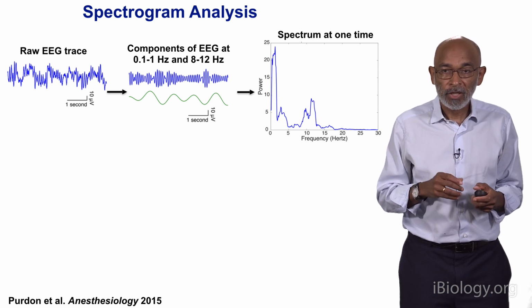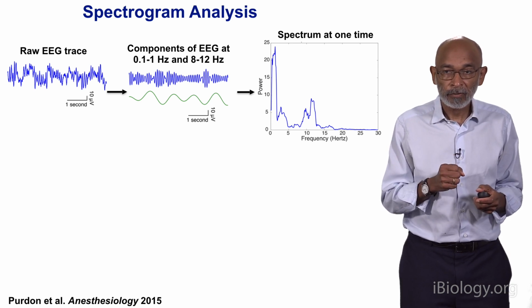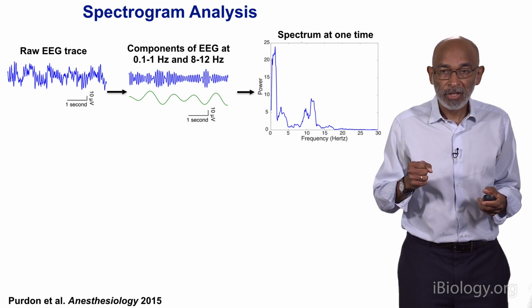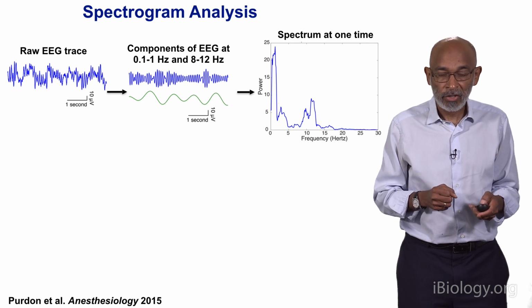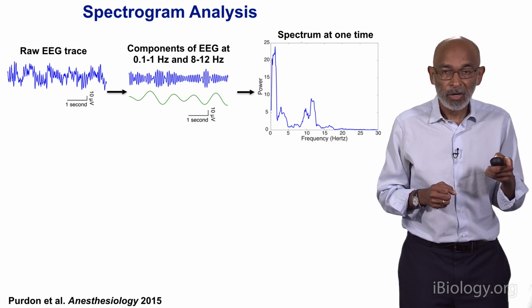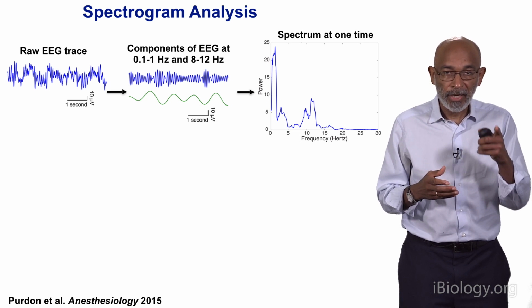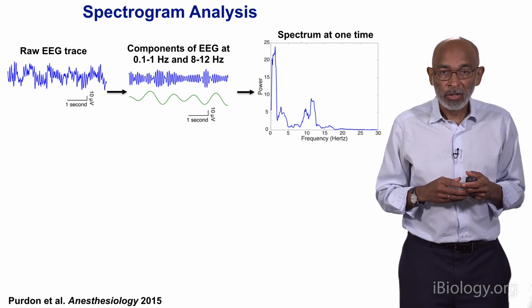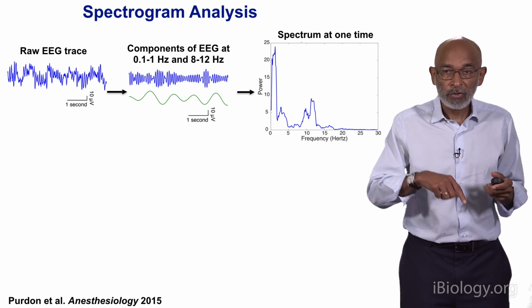And what the spectrum does is it takes a signal and it shows you how big the oscillation is, the amplitude of every oscillation within a given frequency range. So in this particular case here, I'm taking a frequency range from about 1 up to about 30, and that's that signal that I have over there, and I'm showing you its spectrum. So look, you see there's a very large low frequency component there.